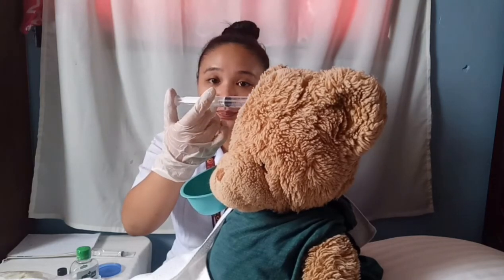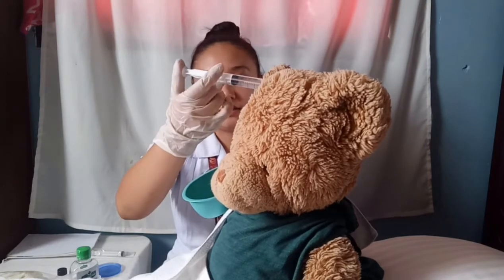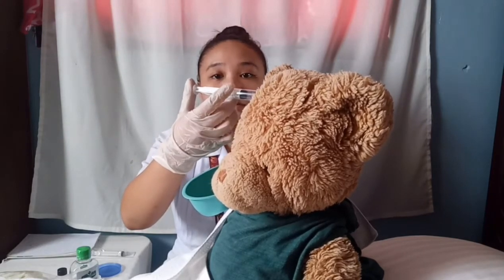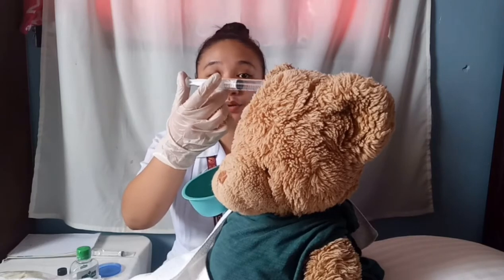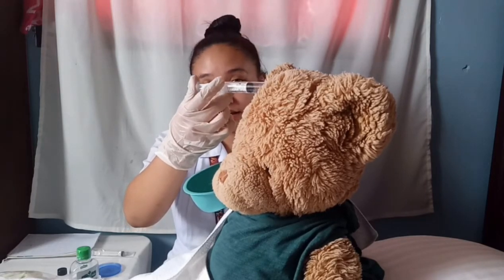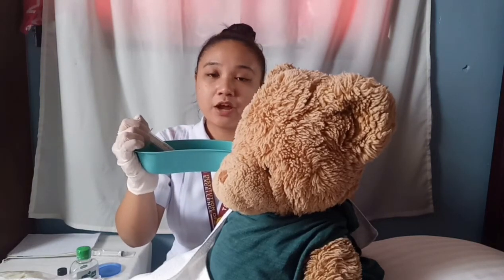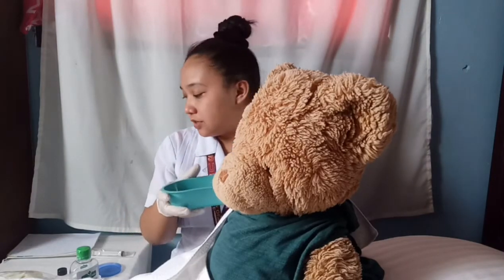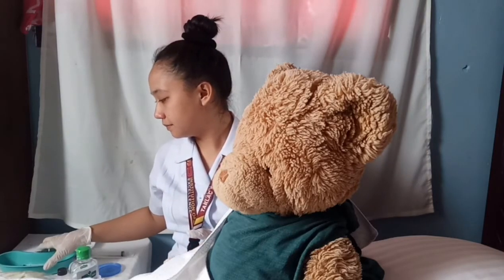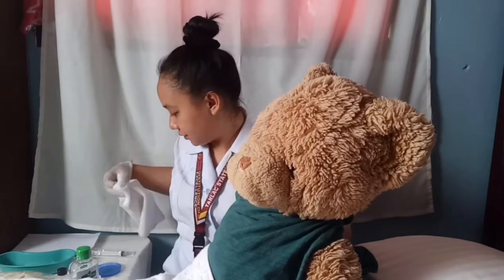And then you need to direct the solution gently upward against the top of the canal. Then continue instilling the fluid until all the solution is used or until the ear canal is clean. But you need to take care not to block the outward flow of the solution with the syringe. And then you need to discard this one and help your patient into a comfortable position, but in a side lying position.